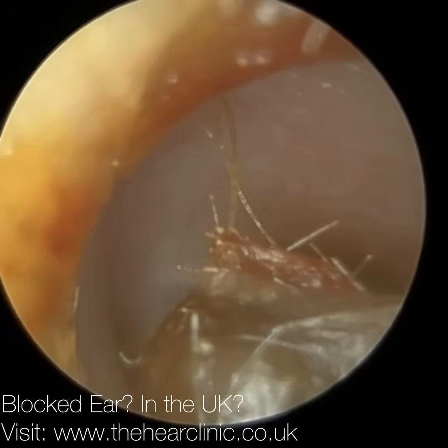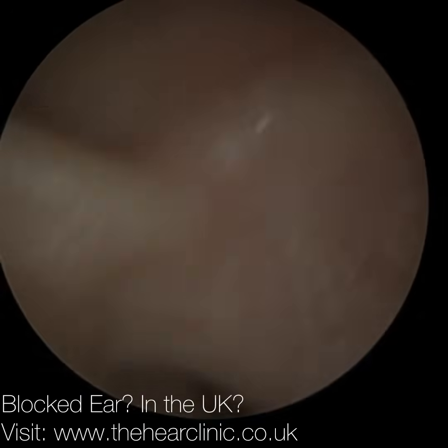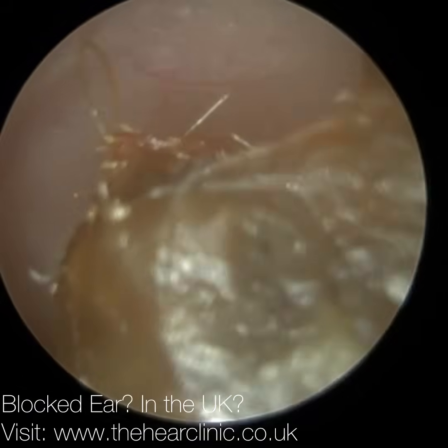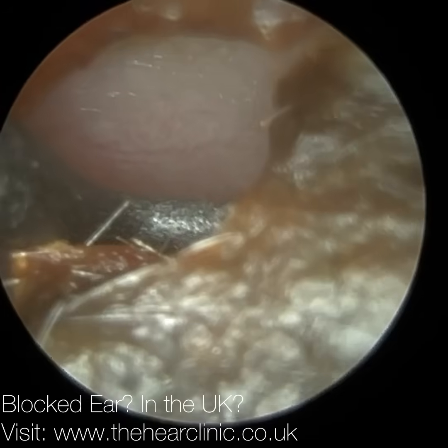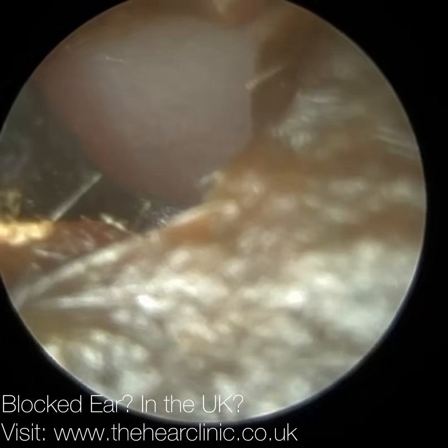Here we have a patient who attended with this really hardened boulder of wax, and there's a nice opening at the roof — perfect for the earhook, and particularly the right-angled earhook, which just allows more manoeuvrability in the ear. I'm better able to manipulate it and position it exactly where I want it.